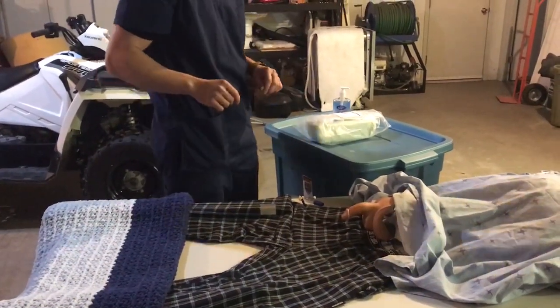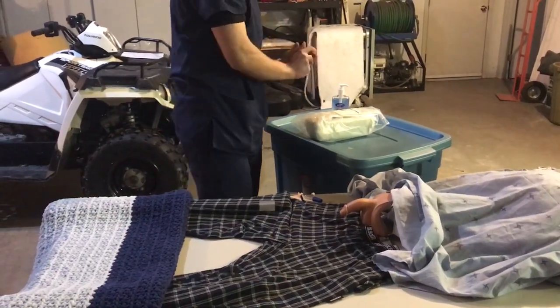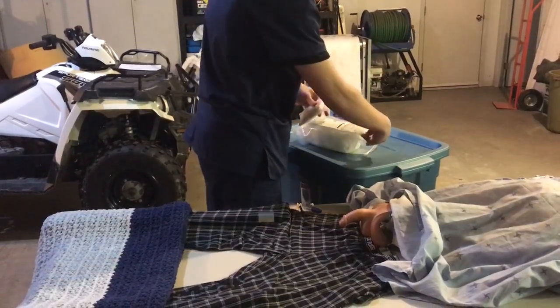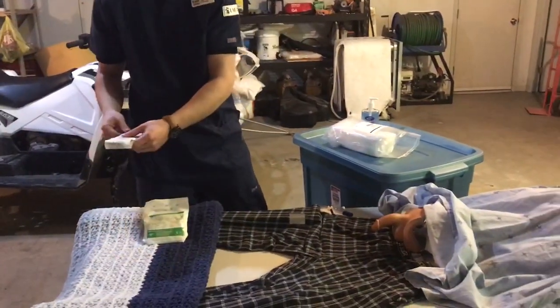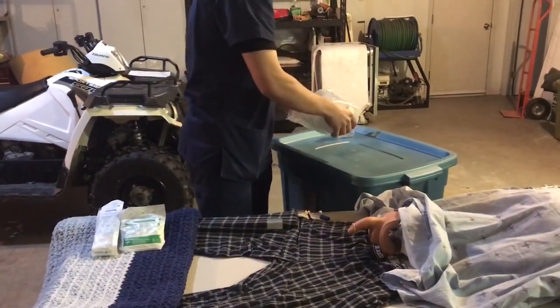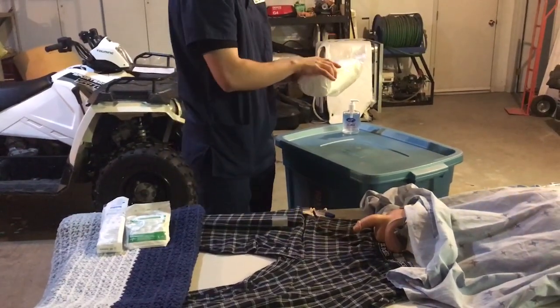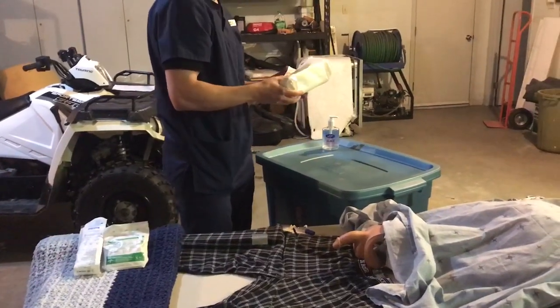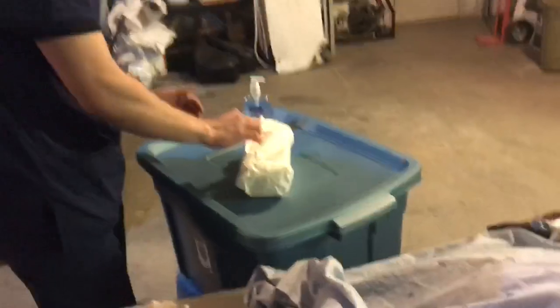So once we are at that point, we can go ahead and I'll do hand sanitizer, and I will remove the contents of my kit here. So I'll put my sterile gloves at the end of the bed here and the catheter tubing there as well. Then I'll pull out my kit here and inspect it to make sure that it's intact. Open it up and place that on my workspace here.